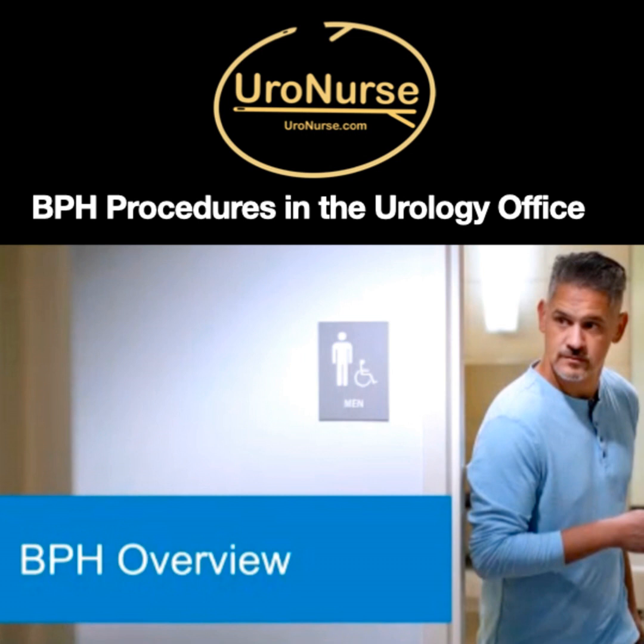So you have to have more than one treatment. If they're saying that Urolift doesn't last as long as Rezum, how long does Rezum seem to last compared to the Urolift? Well, I think if you look at the studies that they've done, they're essentially around the same. Again, it depends on the type of patient selection and the skill of the operator. The bottom line is you pick the procedure that works out best in your hands. The retreatment rate for Urolift is about 14% in 5 years. So they're relatively similar.